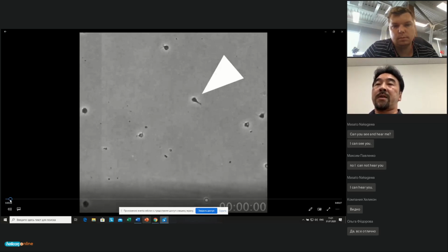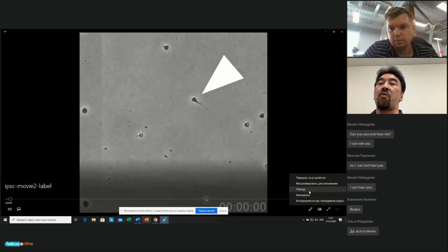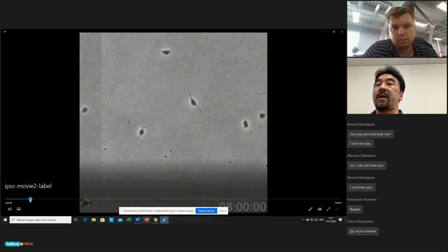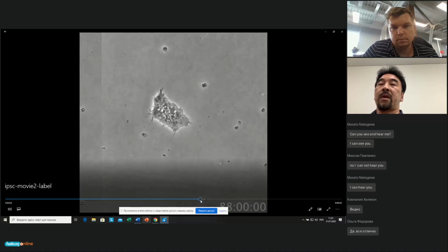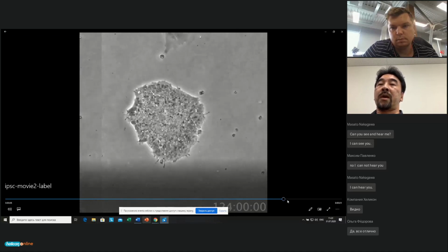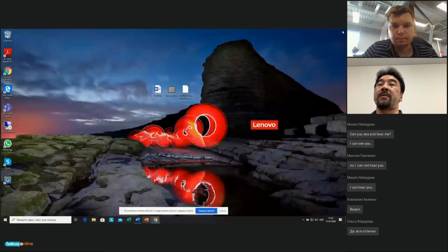So these single iPS cells continue to grow and make a large iPS colony. Please see this movie. The single cells continuously grow and form a big iPS colony like this. Thank you very much. Please move to the presentation file.